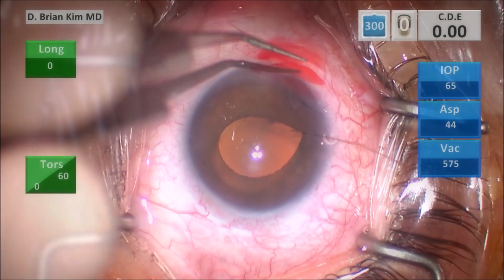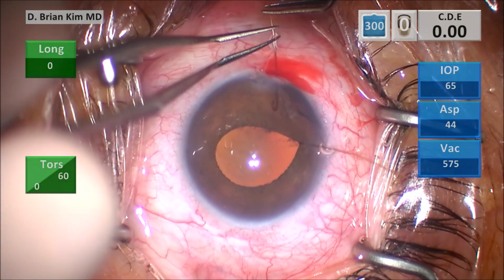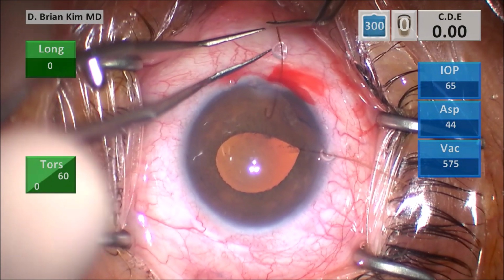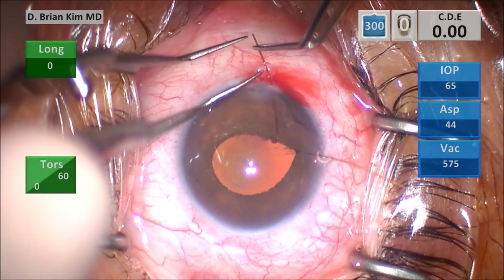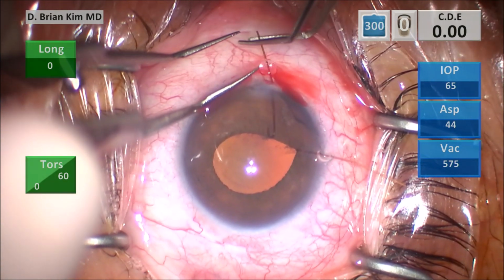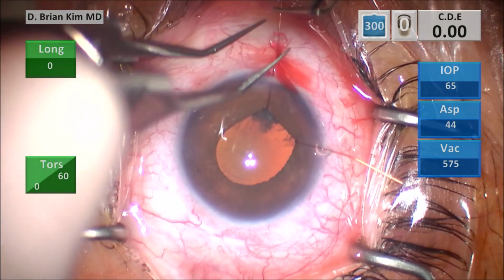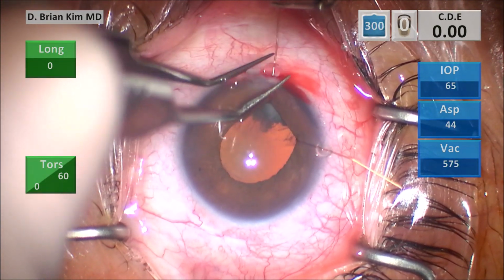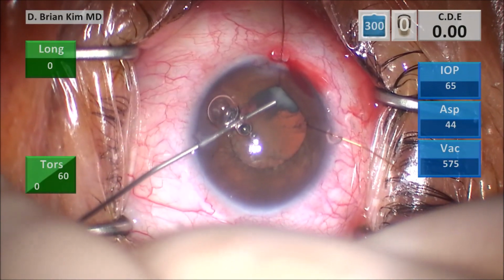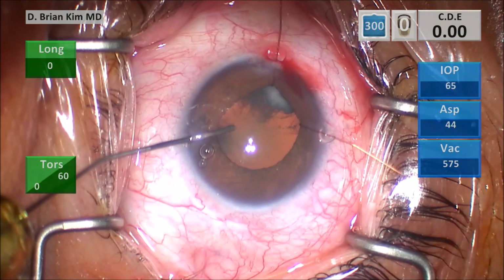So again, placing the hook in, twirling the stopper to get it in position, and then getting it around the edge of the pupil. Just twirl your wrist, there you go, and then cinch it down. That's all you need. I could have put some trypan blue in, but I didn't, and fortunately it wasn't a big issue in this case, but I do think trypan blue might not be a bad idea.